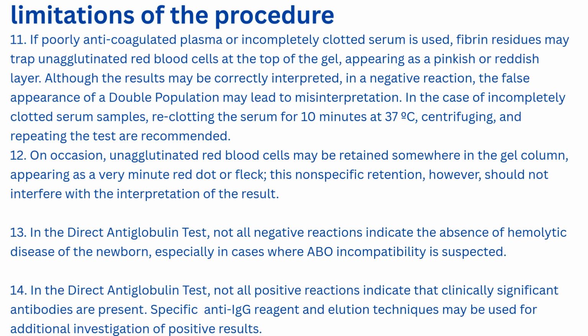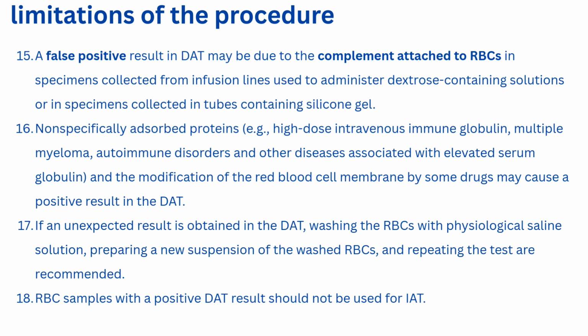And in your DAT, not all negative reactions indicate the absence of hemolytic disease of the newborn, especially in cases where ABO incompatibility is suspected. And lastly, remember that not all positive reactions indicate that clinically significant antibodies are present. So specific anti-IgG reagents and elution techniques may be used for additional observation of positive results.